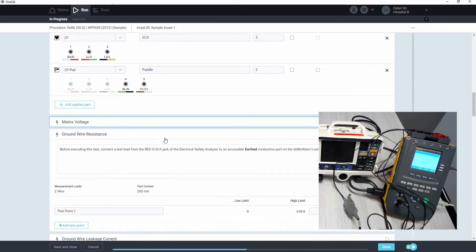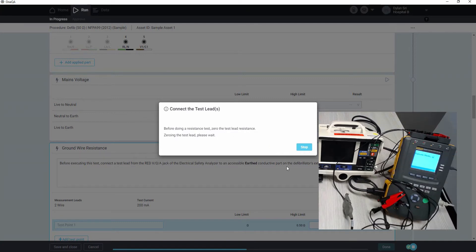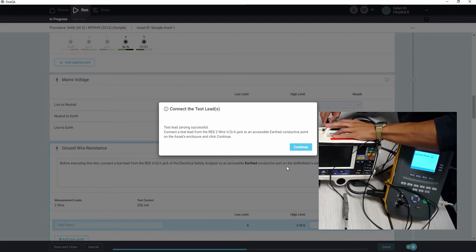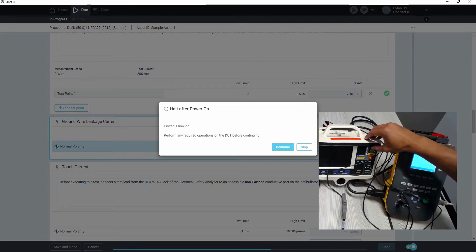Then we'll do an auto sequence of our test. Once it zeros our test lead, connecting it to the null post, and then clicking zero lead. Once that passes, we'll connect to an earth conductive point on the defib. It will give us a chance to turn on the defib when power is applied from the ESA, and then we can continue.